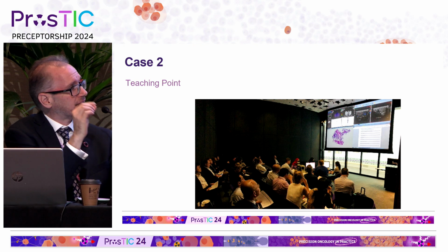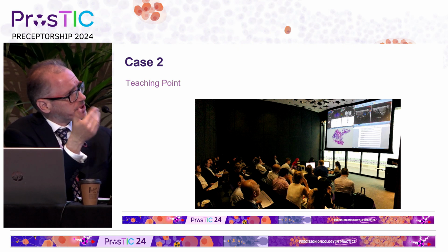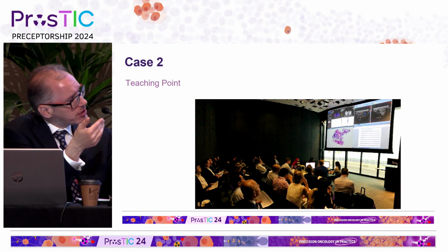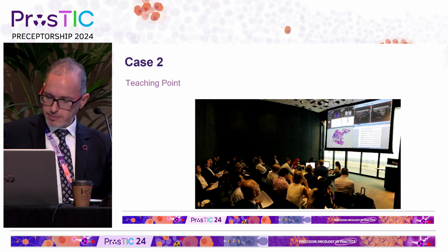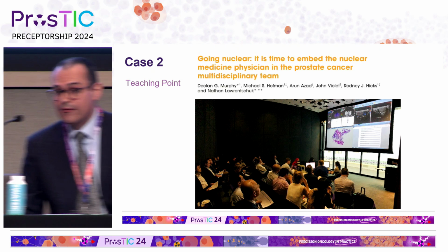And the key here is that there's a single one in a patient with an intermediate risk prostate cancer. So when you add that pre-test probability, you're a little bit less certain, and then you do the MR and maybe a biopsy.